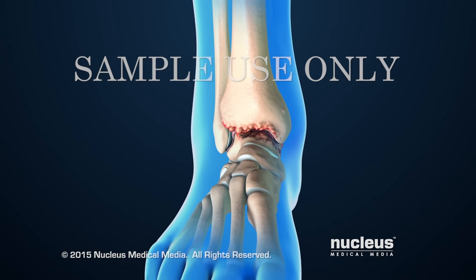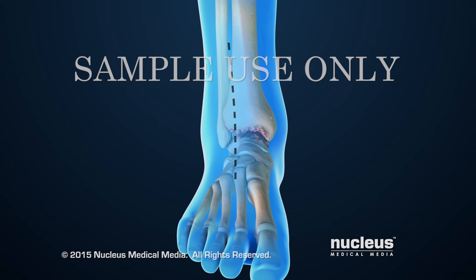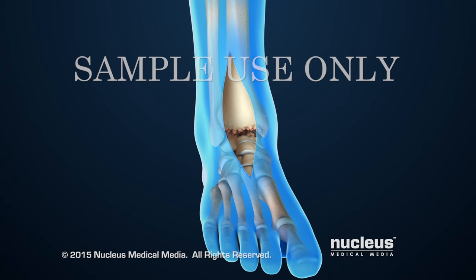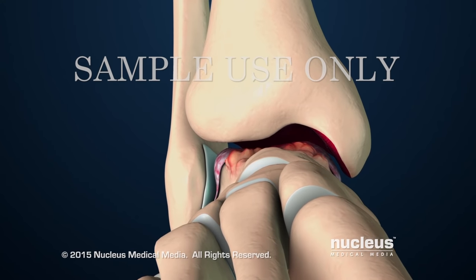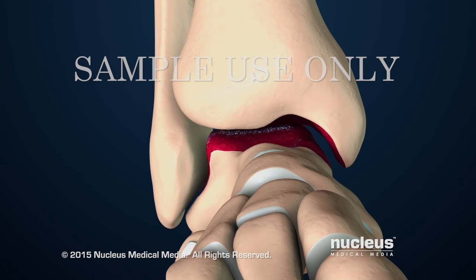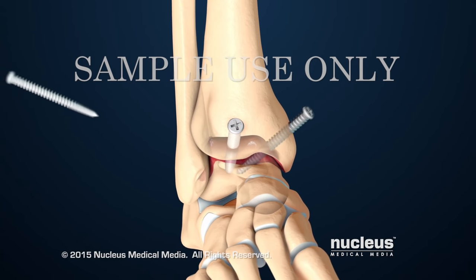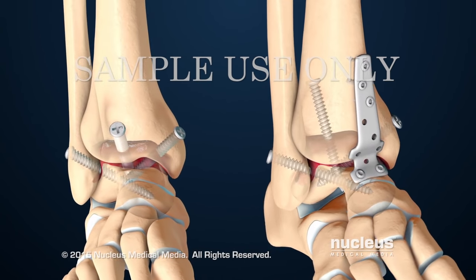The procedure will begin with an incision on the front, or anterior, part of the ankle. Next, the surgeon will open up the ankle to see inside the joint space between the tibia and talus bones. Damaged cartilage and bone will be removed from the bottom surface of the tibia and the top surface of the talus. Then, the surgeon will attach the bones to each other with screws or with a metal plate and screws.